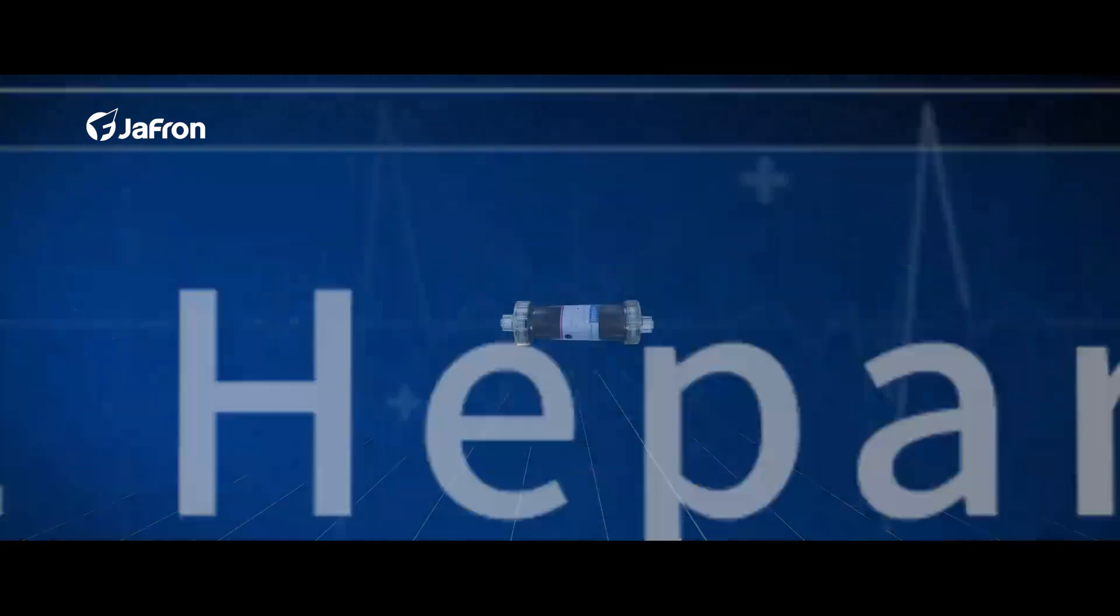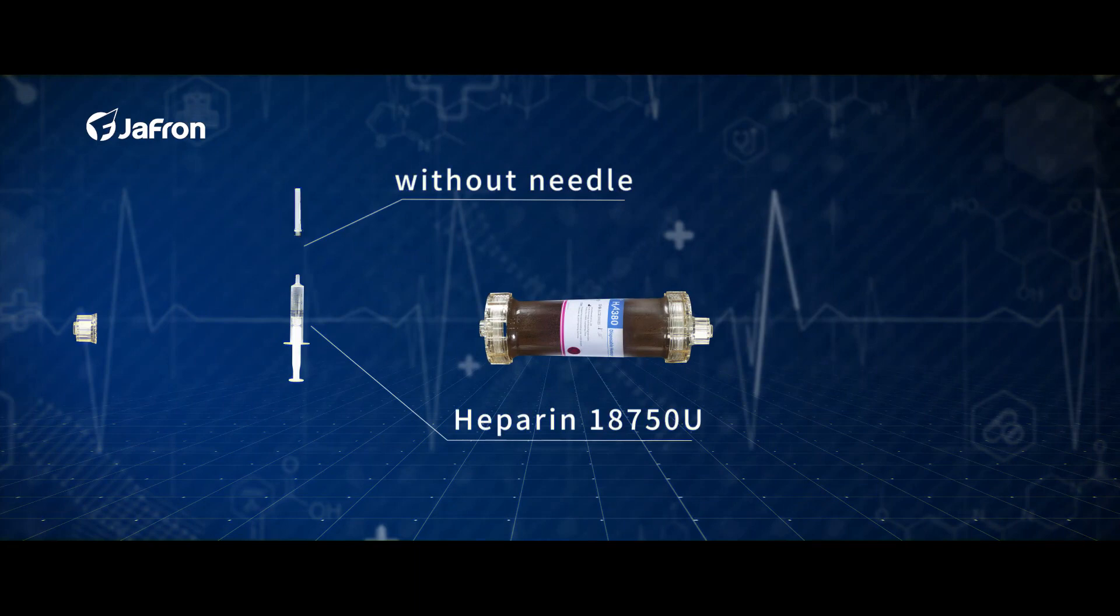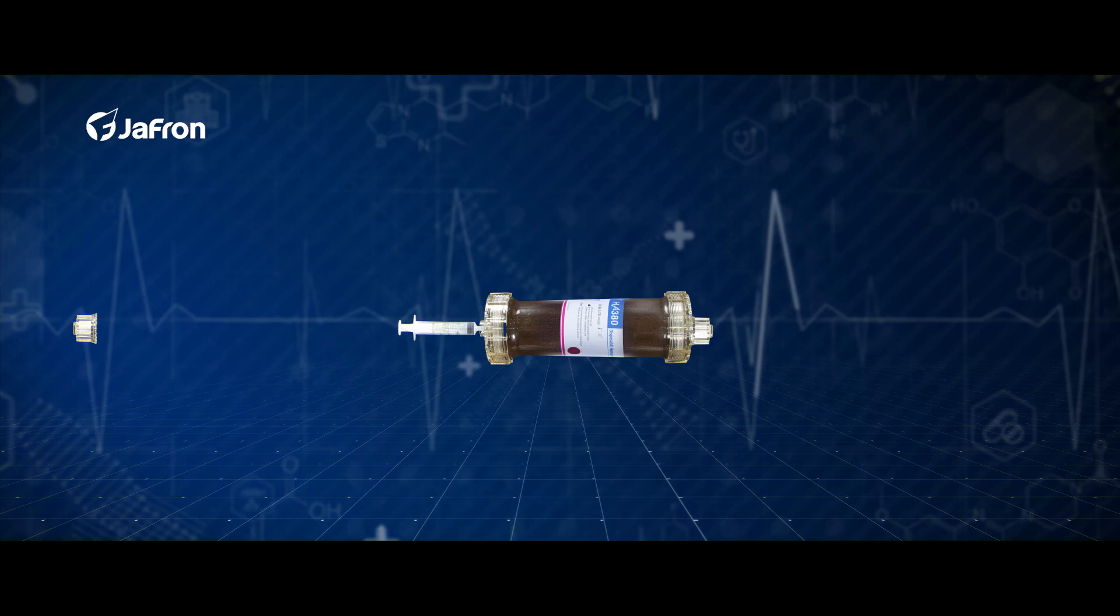Part 2: Heparinization. Unscrew one cap of the cartridge. Use a 5ml syringe without needle to inject 18,750 units of heparin into the cartridge.